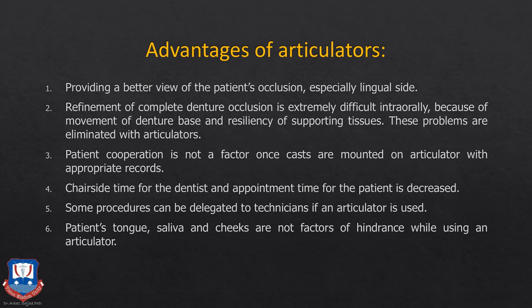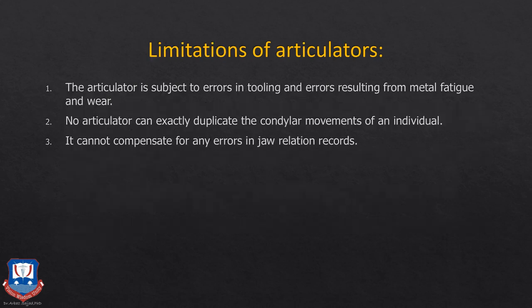And finally, the patient's tongue, saliva, and cheeks are not factors here. You are just working with the upper and lower models and fabricating the restorations that you need to fabricate. Moving on, however, articulators do have certain limitations.